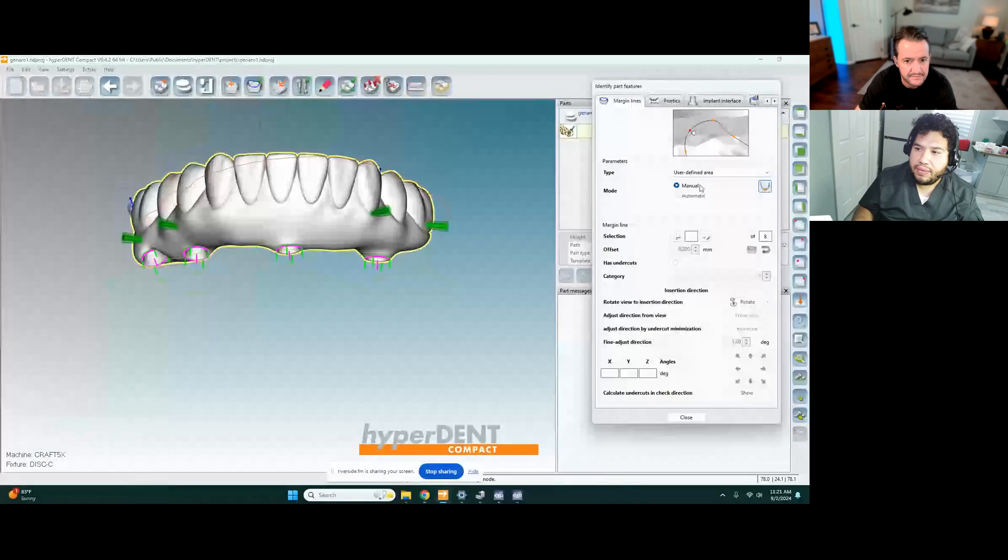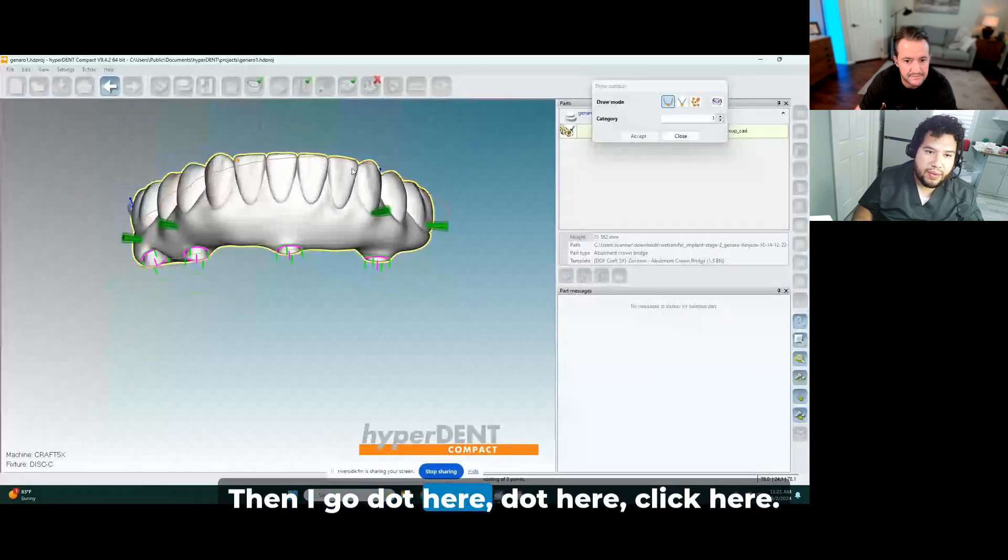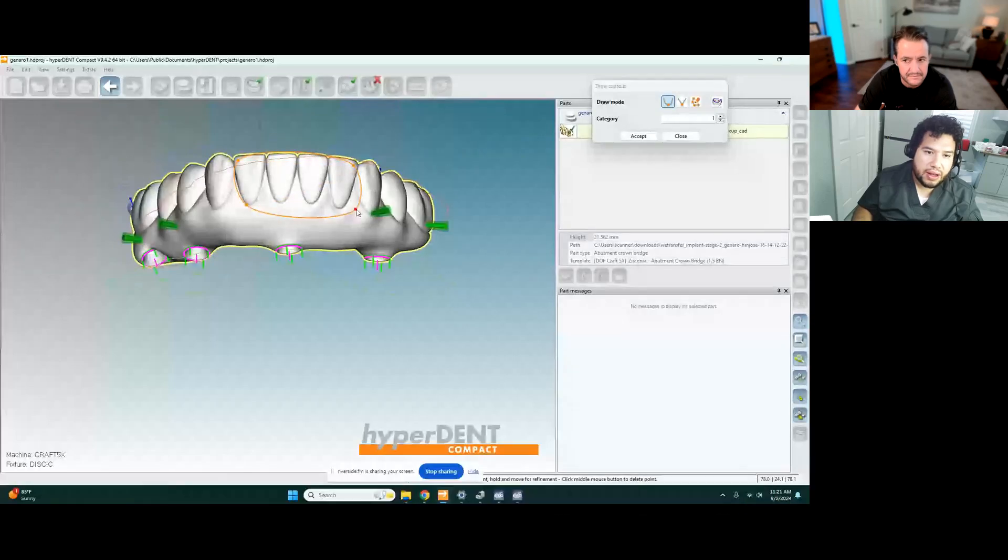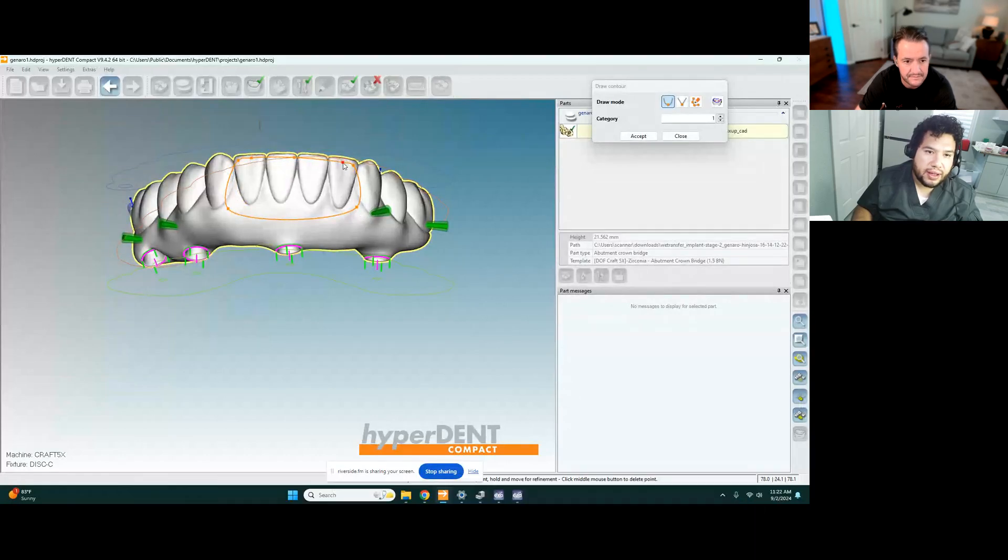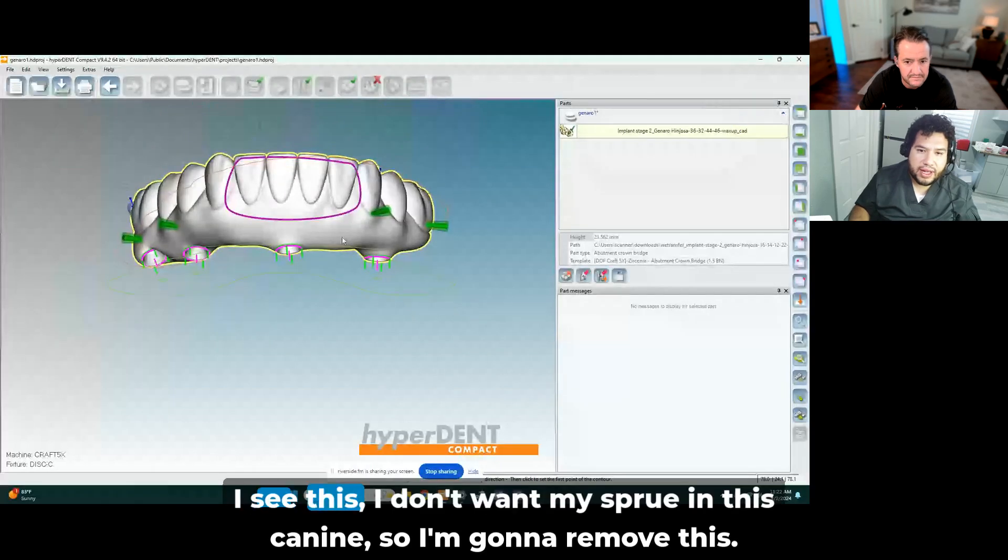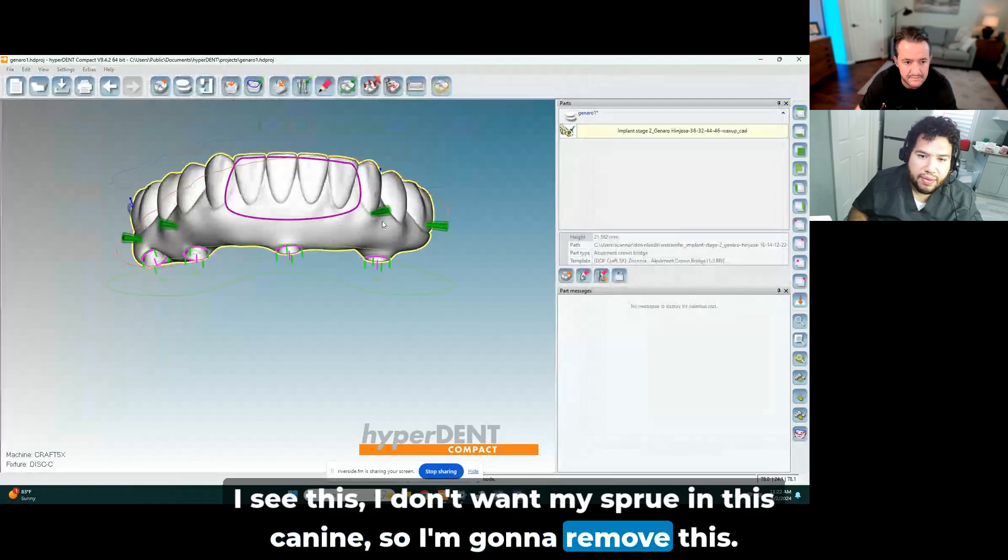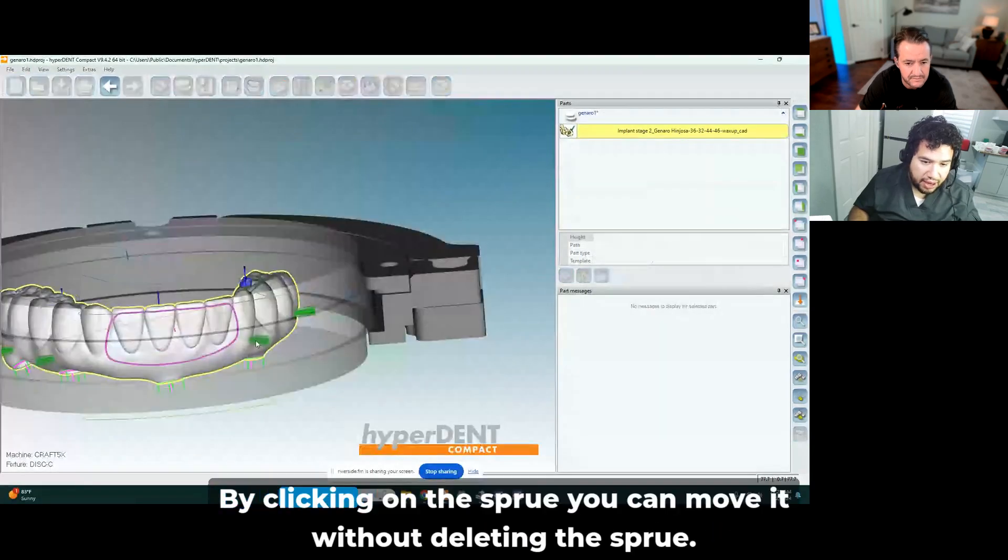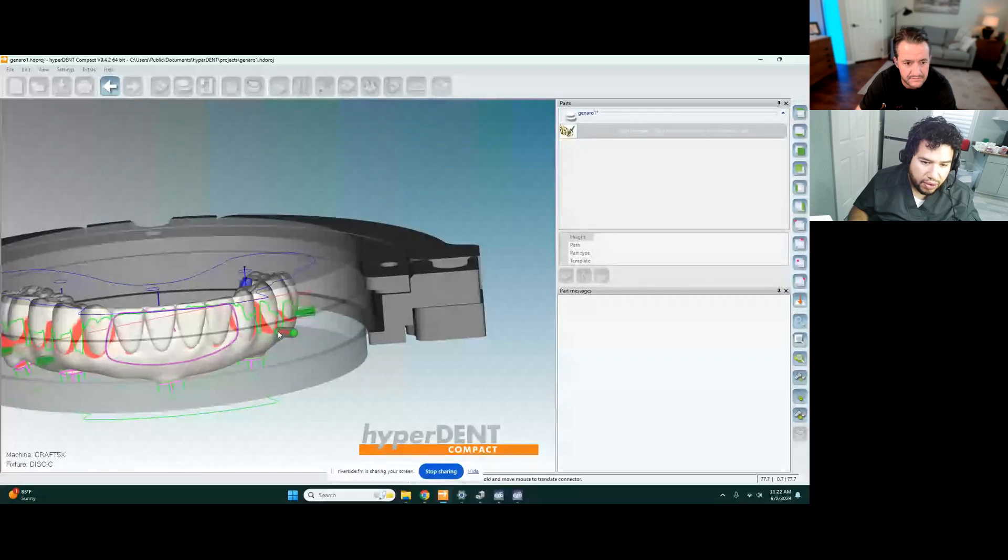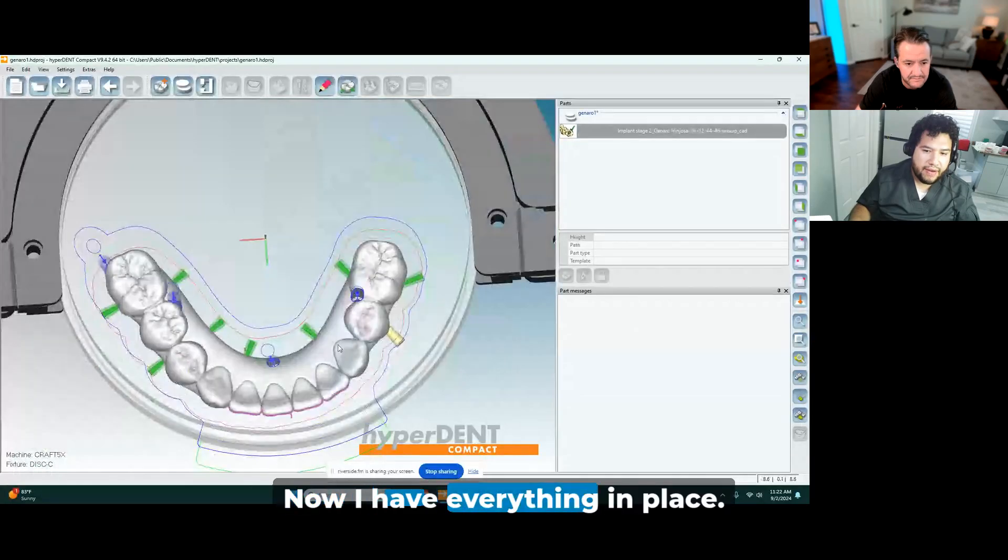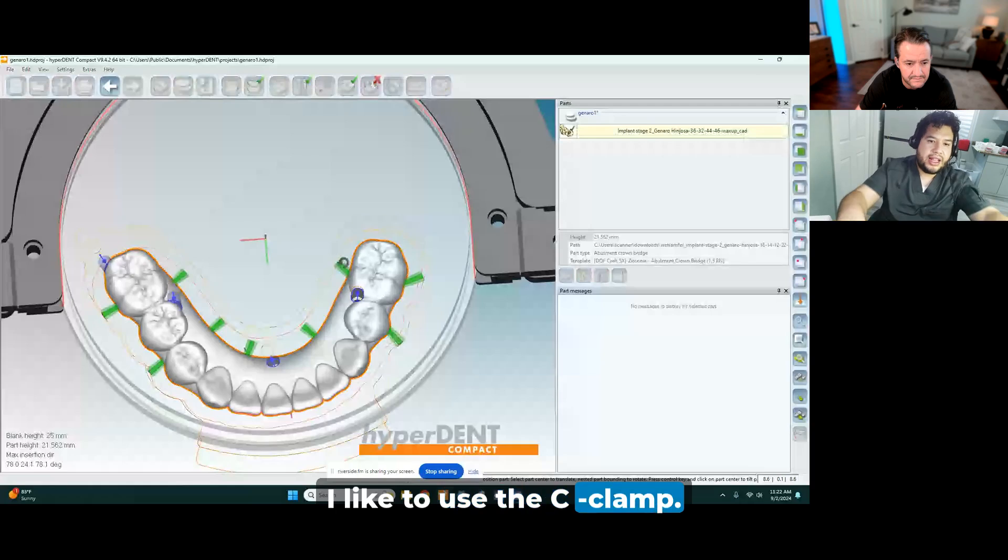User defined. Then I go, dot here, dot here, dot here, click here. And I don't want to overpass the incisor edge. So I go here. Okay. Also I see this, I don't want my sprue on this canine. So I'm going to remove this by clicking on the sprue you can move it without deleting the sprue. Oh nice.